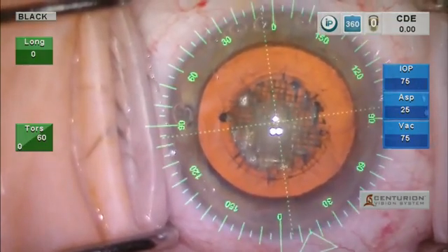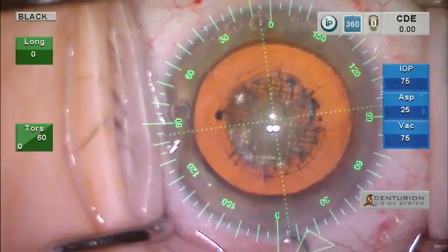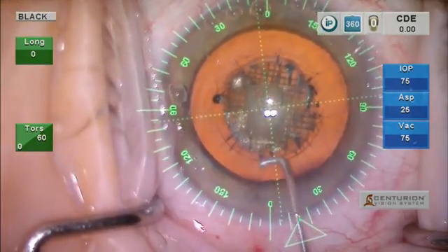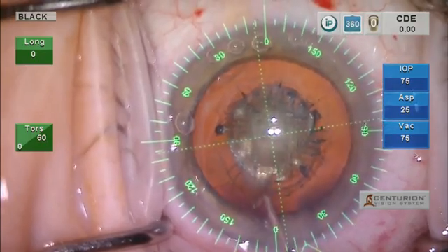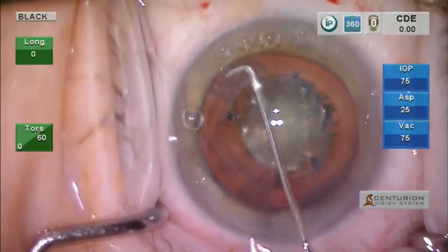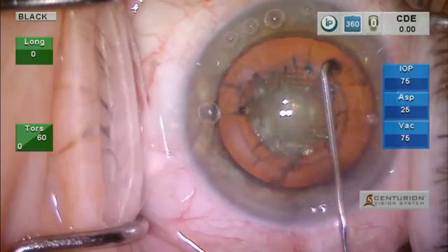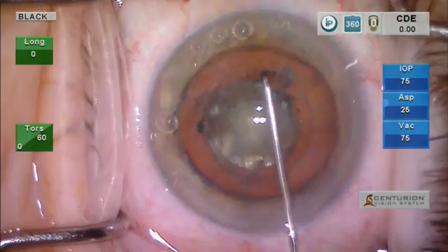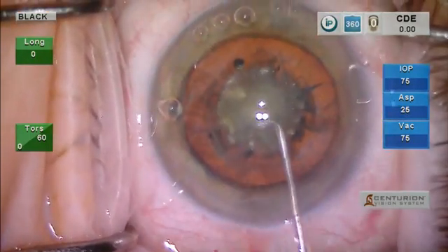This is a 2.3 incision with a reverse trapezoid going to a 2.5 internally. We use the Chang hydro-dissection cannula. I like to hydro-dissect sub-incisionally first. As you will notice, there is no side port incision here. This will be a one-hand technique using a pre-chopper, so we want to make sure we get a very complete capsulotomy so the nucleus rotates.